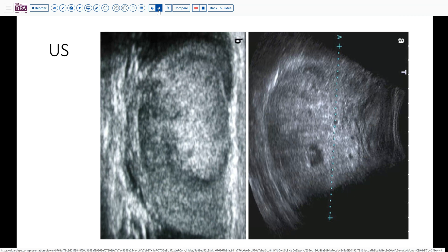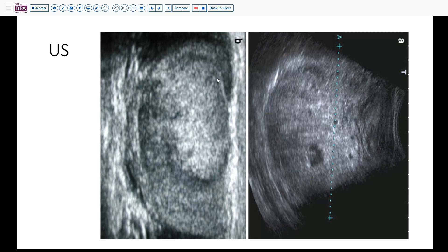Here is a representative ultrasound. As you can see, the gonad is somewhat smaller than typically expected in a 17-year-old — probably less than a centimeter, maybe two centimeters at most. You can see this fluffy white hyperechoic stranding in the tissue, which is probably indicative of calcification.